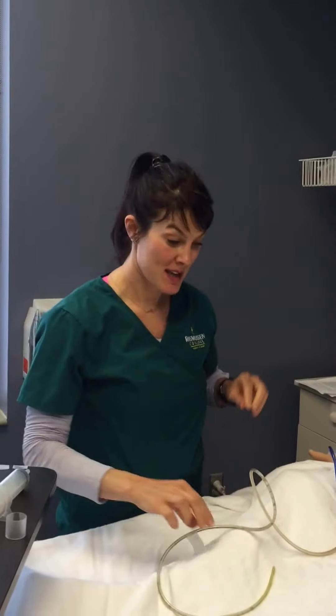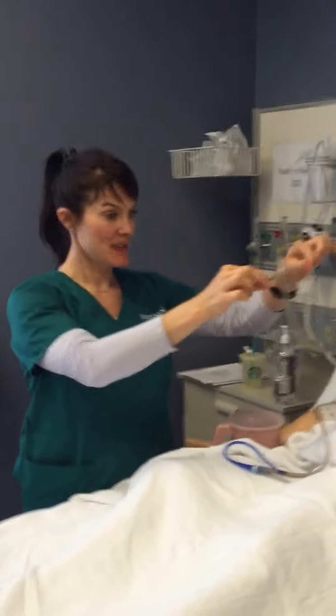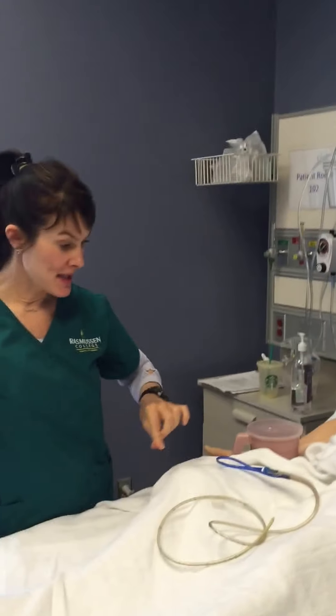I have my other tape cut and I'm taping it right now. I'm going to get my gloves and perform my hand hygiene.